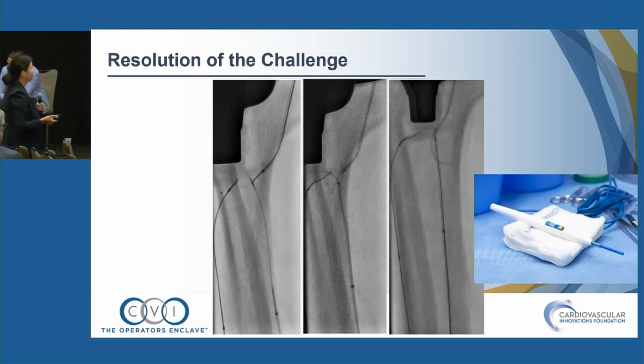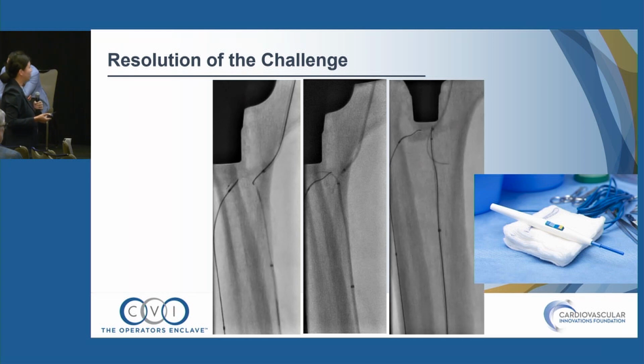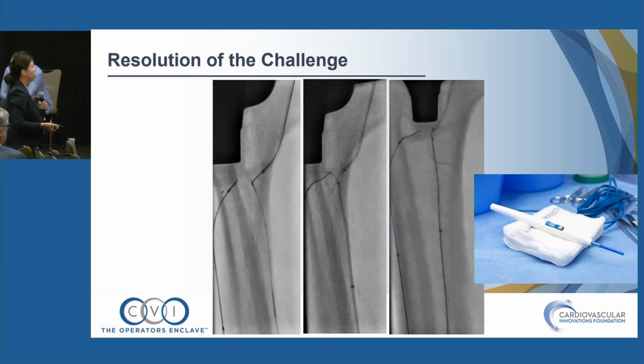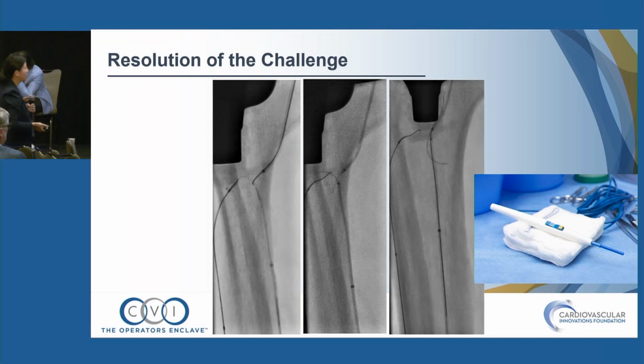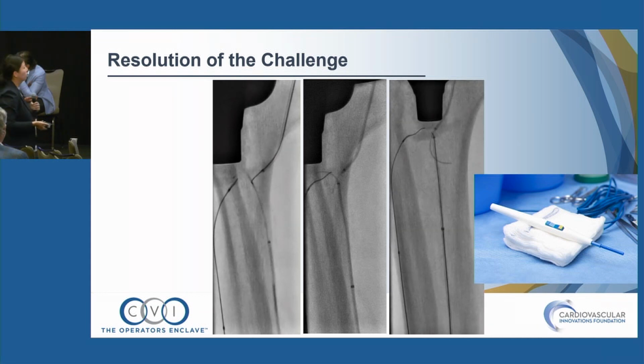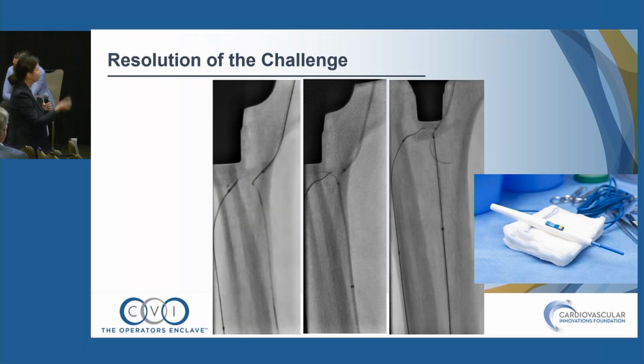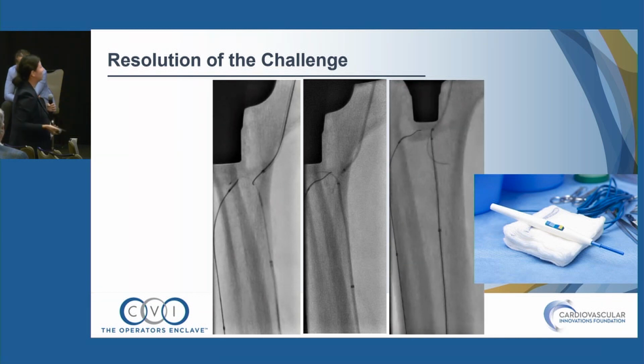So I ended up doing something that I haven't really done before in this case. This was electrocautery, it's called ECART, to essentially burn a little hole in the subintimal space. This was using a Connect 250T along with the little Bovie on the back end of the wire. As my vascular surgery fellow buzzed, we were able to penetrate into the subintimal layer and into the P3 segment in a true lumen fashion.